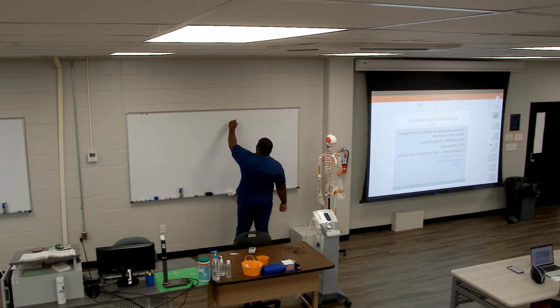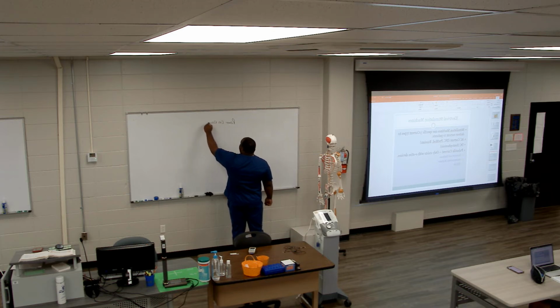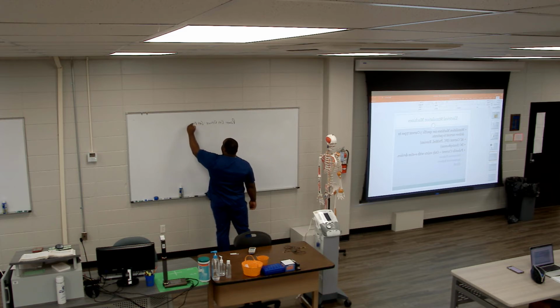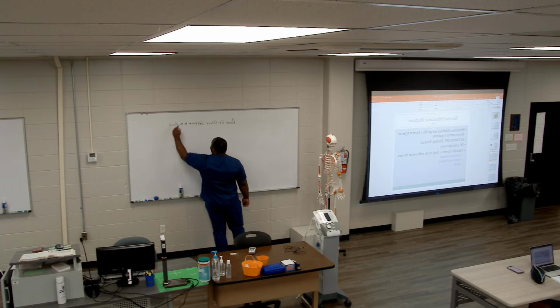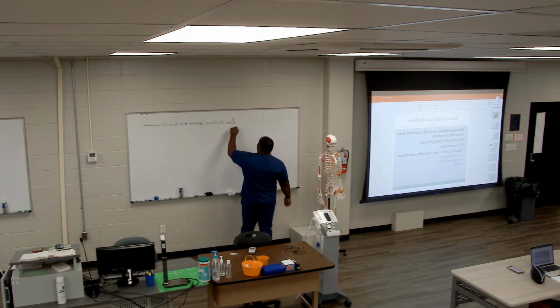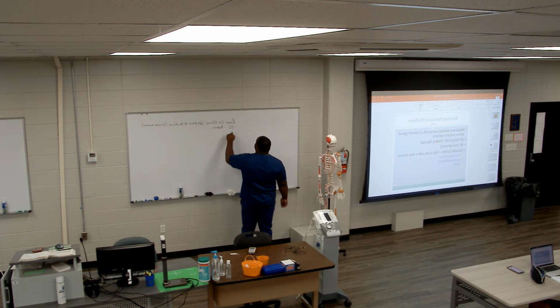When we're powering on the actual E-Stim machine, we can do that either through direct current, which means batteries, or alternating current, which means wall plugs.